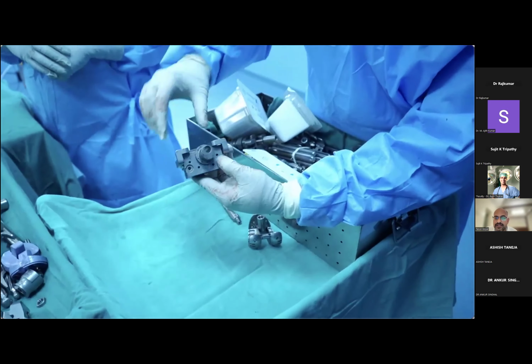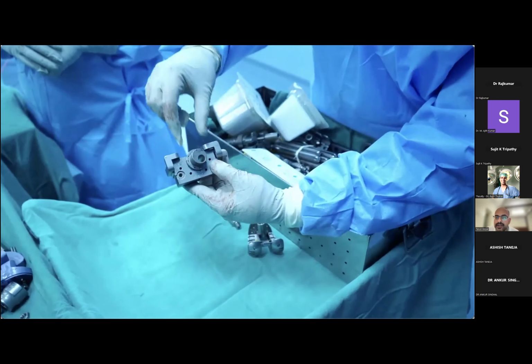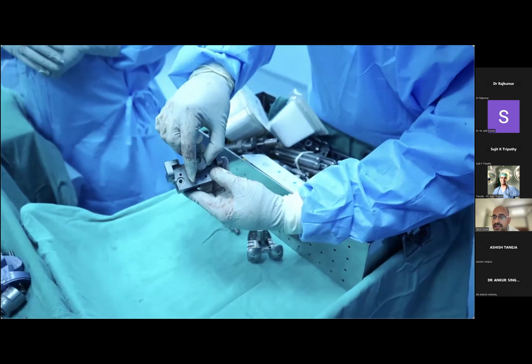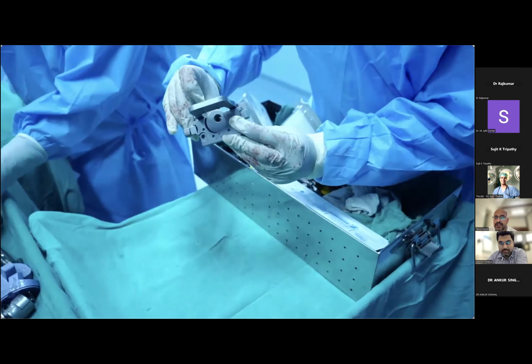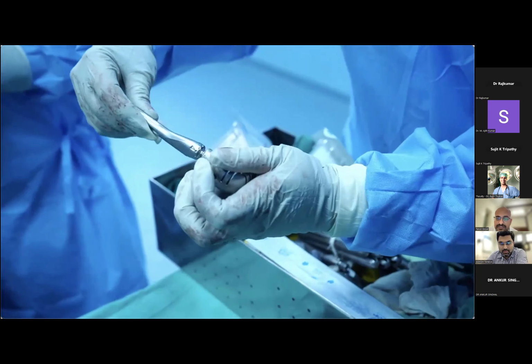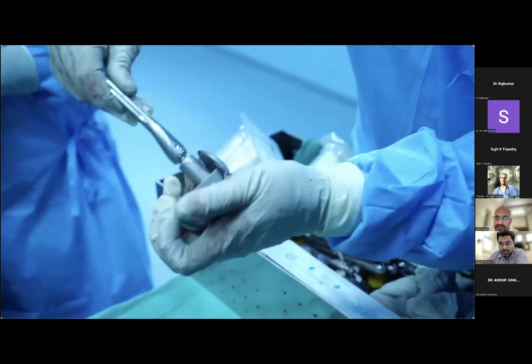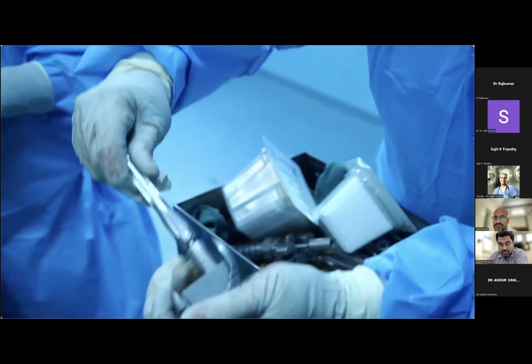This is the offset component. The offset direction can be adjusted as per the need, depending upon the location of the intramedullary canal in relation to the tibial or the femoral component. Similarly, the offset stems will have to be put in place. You can see the angle of the offset stems will be adjusted according to the location of the intramedullary canal.